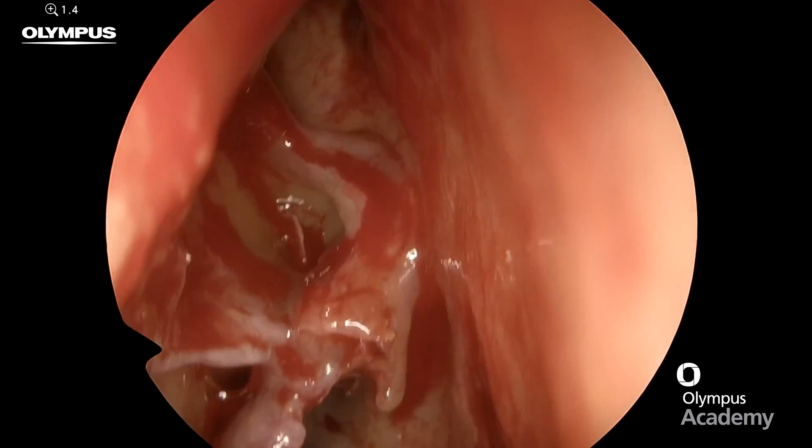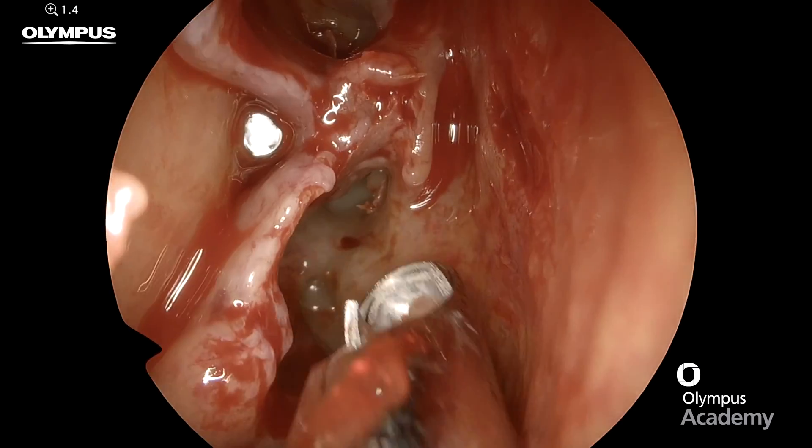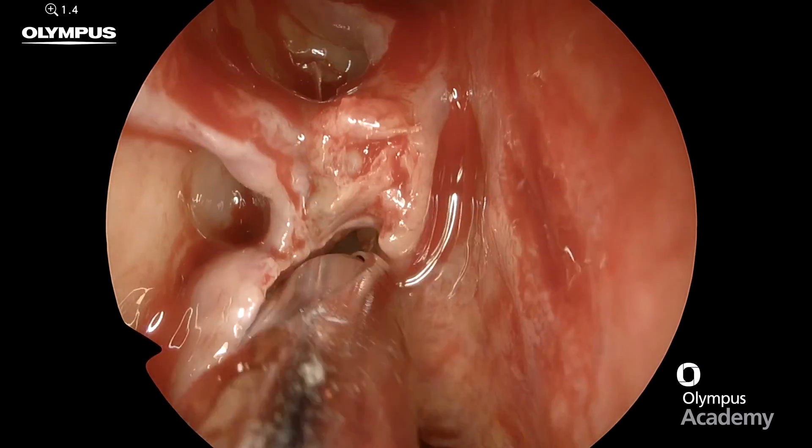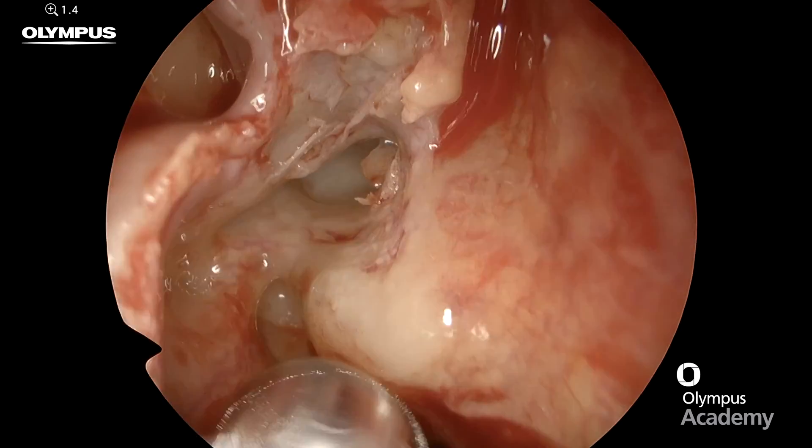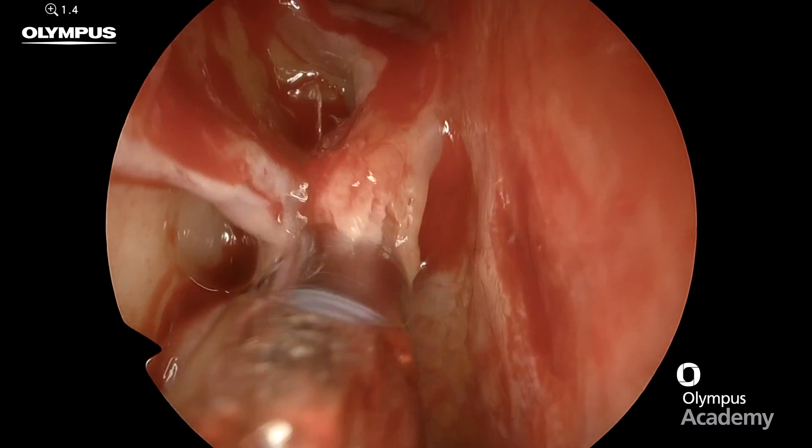It's important that you can see the tip of your microdebrider blade at all times to avoid damaging the lamina papyracea. These large fragments you can see there are just going right into the microdebrider.